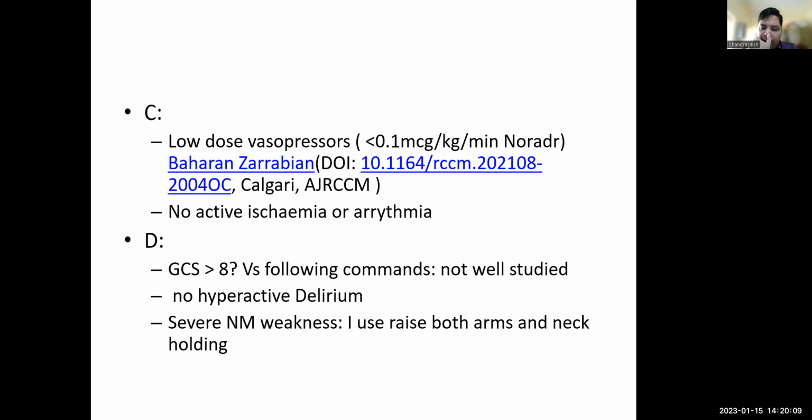once we start taking somebody off positive pressure ventilation, slowly reducing their positive pressure ventilation, the heart-lung interaction is such that in a weak heart, the preload will increase, the afterload will increase, and that's going to make the heart more prone to failing, and the myocardial oxygen demand will go up, so that will increase the chances of arrhythmia and ischemia. We'll talk about weaning in cardiac patients in a little while.